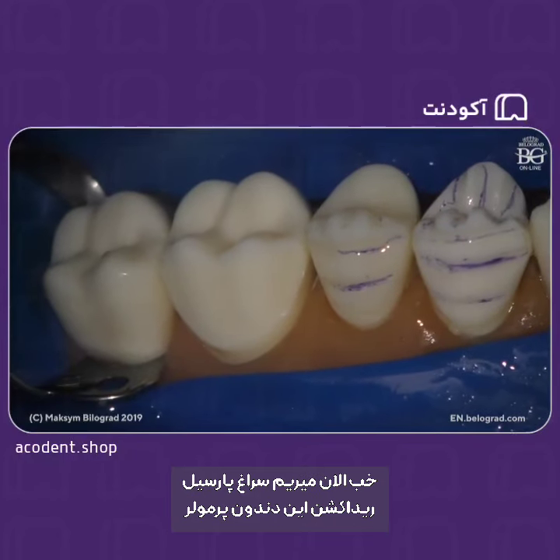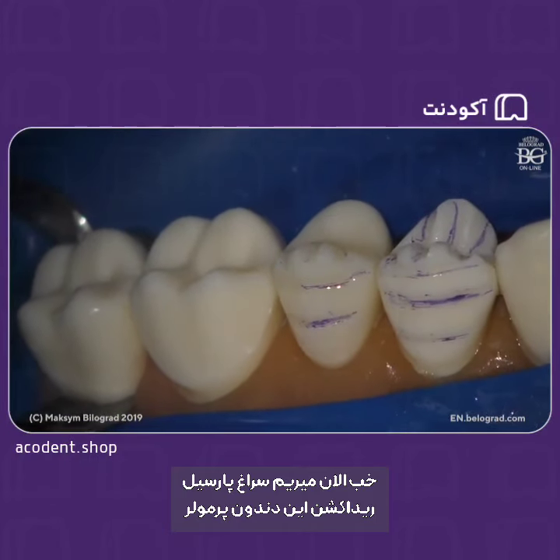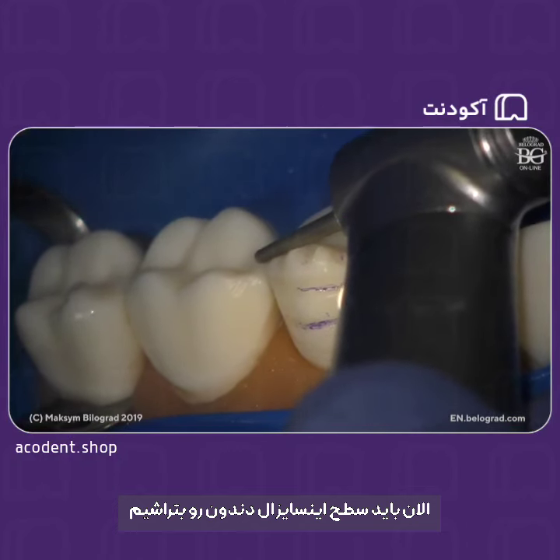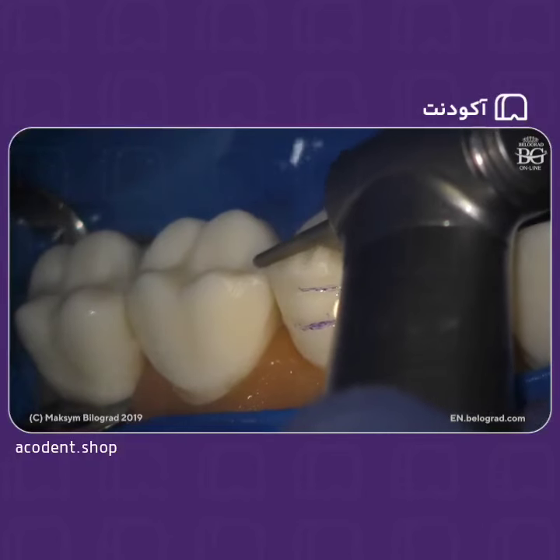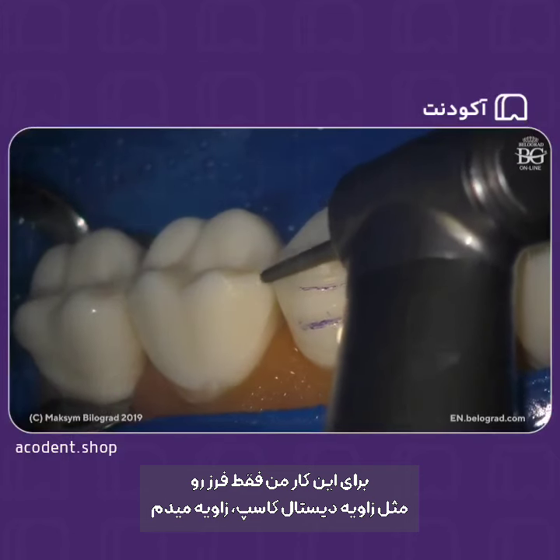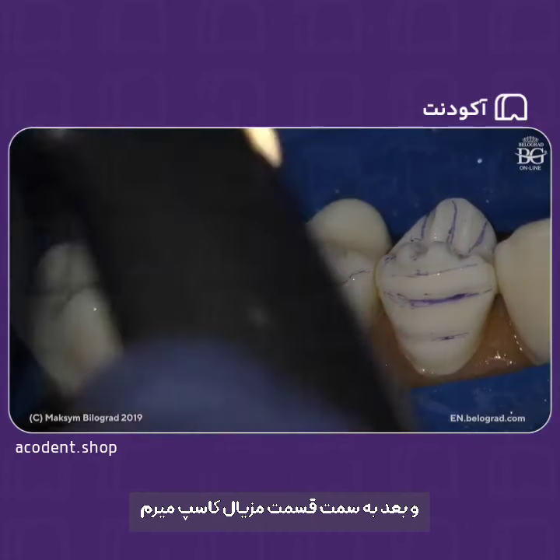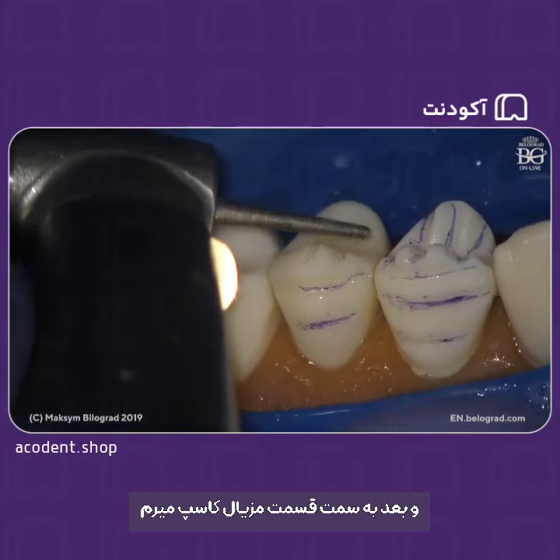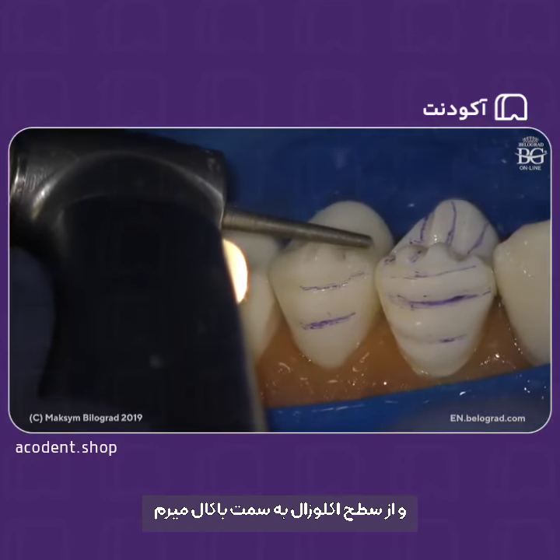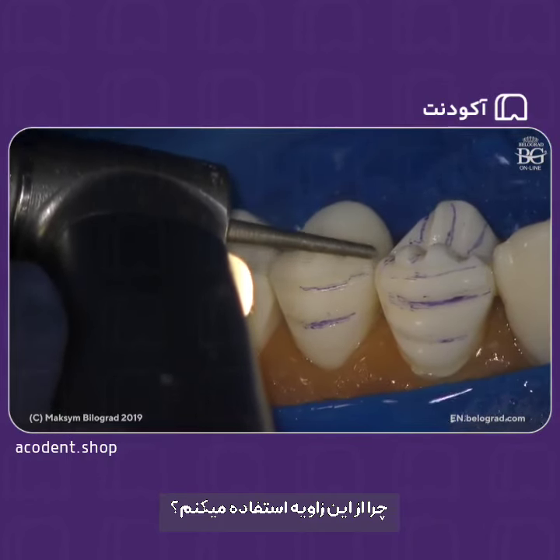So now we go for a partial reduction. Okay, this is a premolar, and now we have to cut the part of the tip. And see how I do this? I just angulate my burr the same as the distal angulation of the cusp. Then I will turn my burr towards the mesial aspect of the tip of the cusp, and I'm going from the occlusal surface towards buccal.